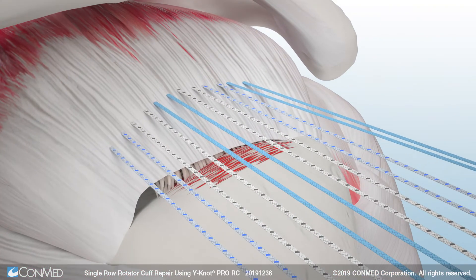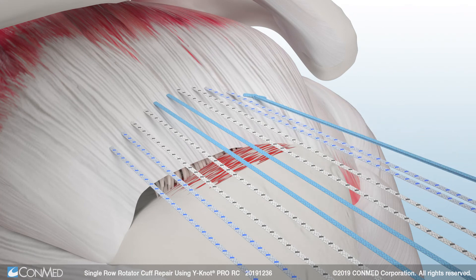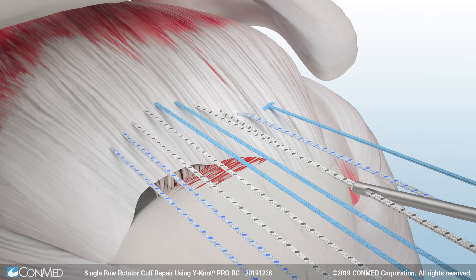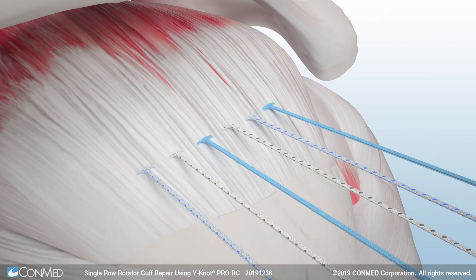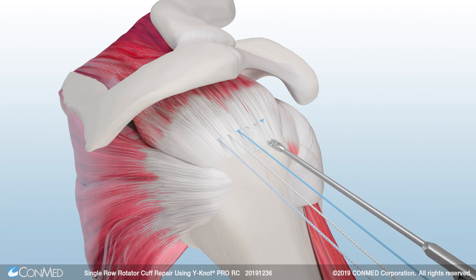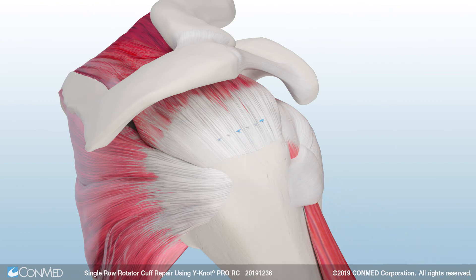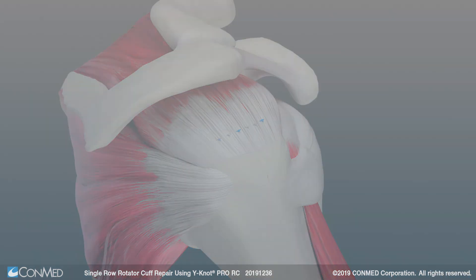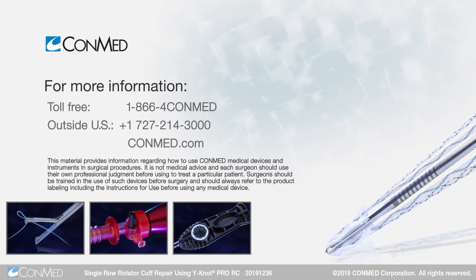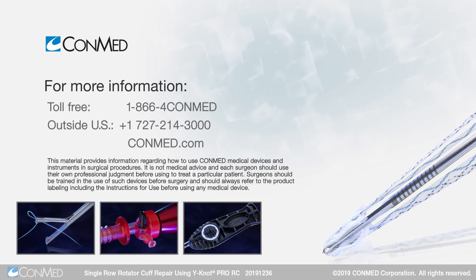ConMed's Hi-Fi ribbon is a flat, tie-able tape that provides broad compression and increased tendon-to-bone interface. Finally, use the Katana Flush Cutter, which can cut up to two limbs of number 2 Hi-Fi Suture, Hi-Fi Ribbon, or Hi-Fi Tape. This completes the Single Row Rotator Cuff Repair.